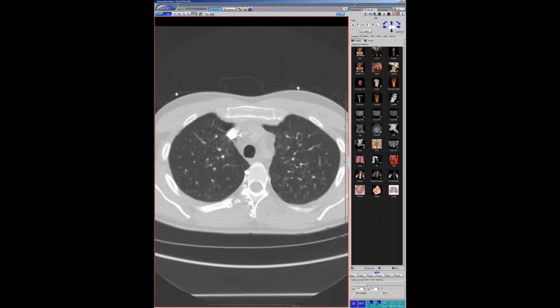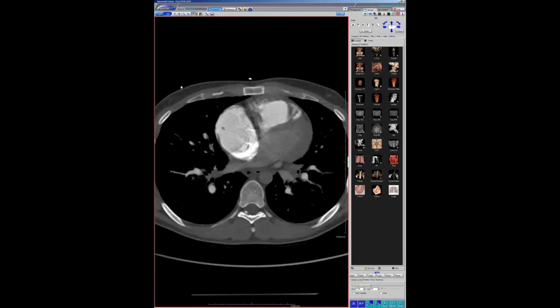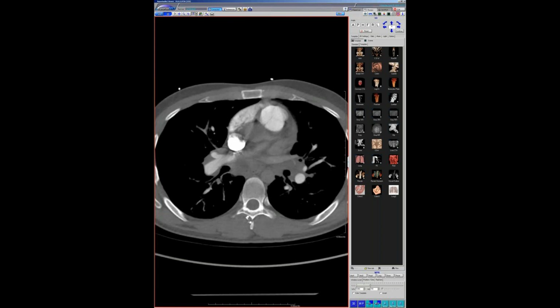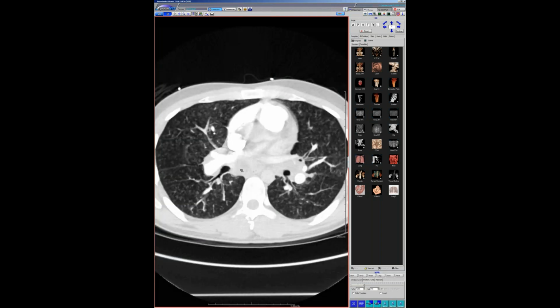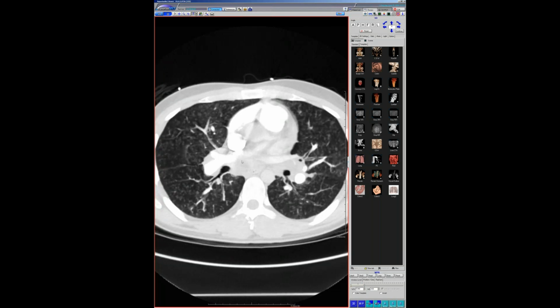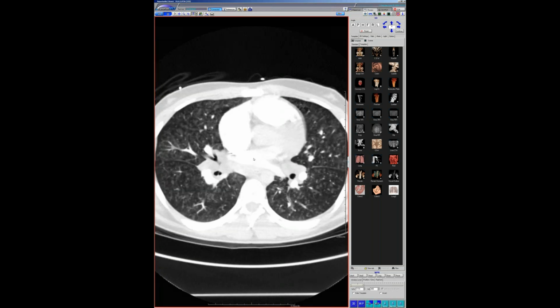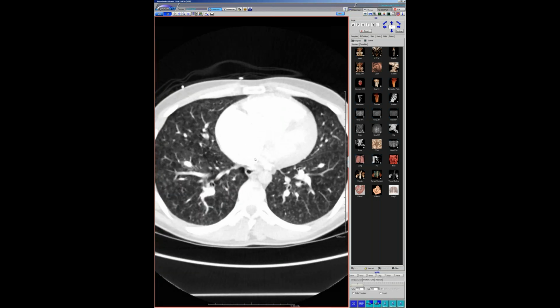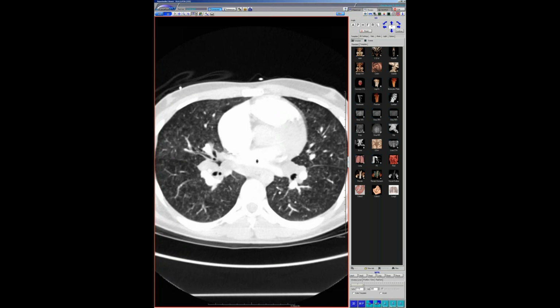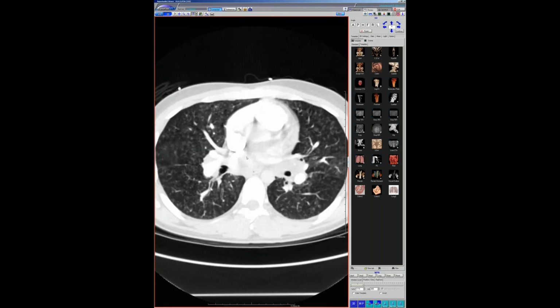It doesn't look like those fuzzy-ish nodules you see with PAH. The other striking thing was the amount of lymphadenopathy he has. I know you can get secondary causes of PCH and especially PVOD occasionally with sarcoid. I know they're one disease now and considered PCH / PVOD, but imaging wise, they do look a little bit different. And you have some cases that clearly look like PVOD and some that clearly look like PCH, at least on imaging.